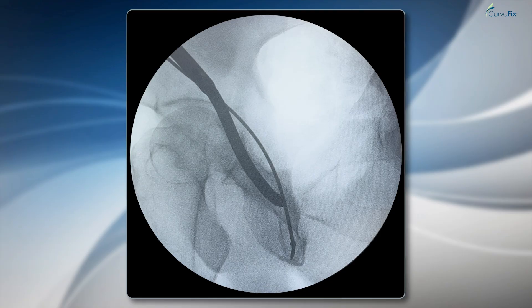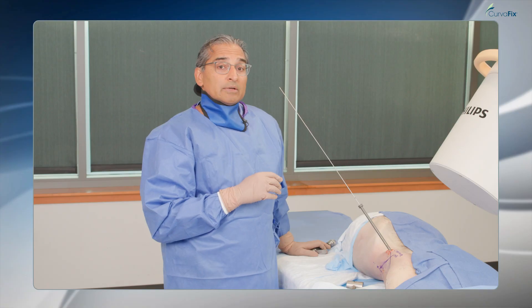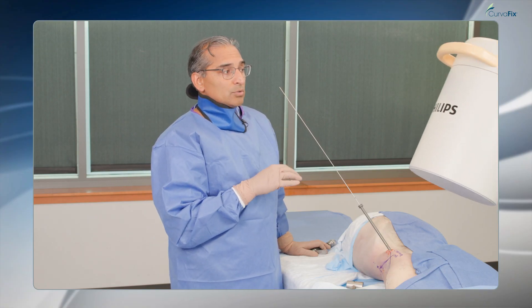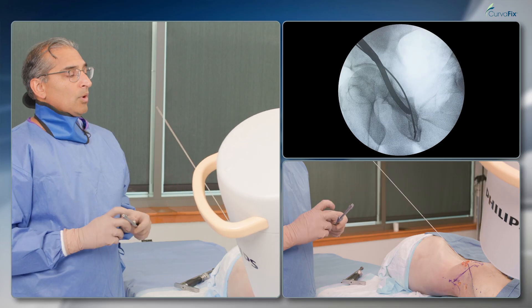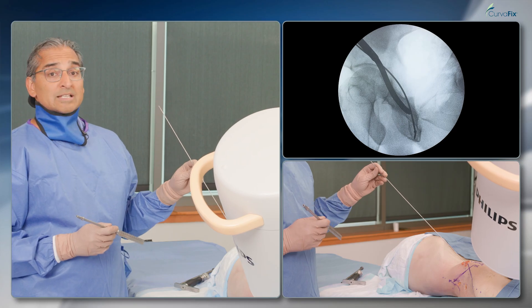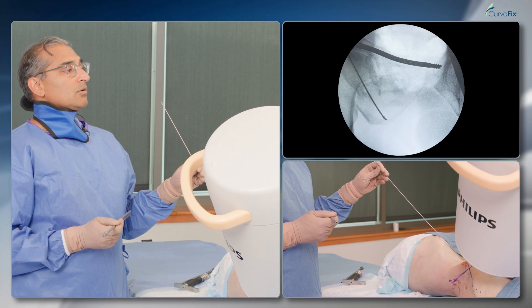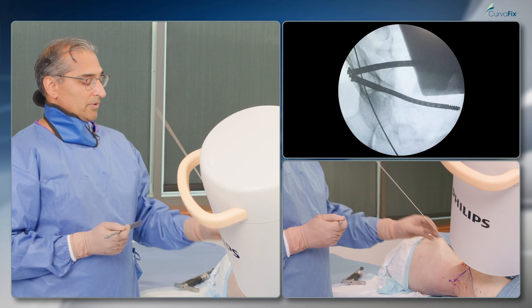I've got the wire right now in the right orientation. On the obturator outlet view you can see the wire going around the acetabulum into the posterior column. This is a challenging wire and screw to place, but once you can navigate around the acetabulum on these two views, it's very powerful to be able to place the screw and capture the entirety of the posterior column. You can see the wire going right down that posterior column very nicely.